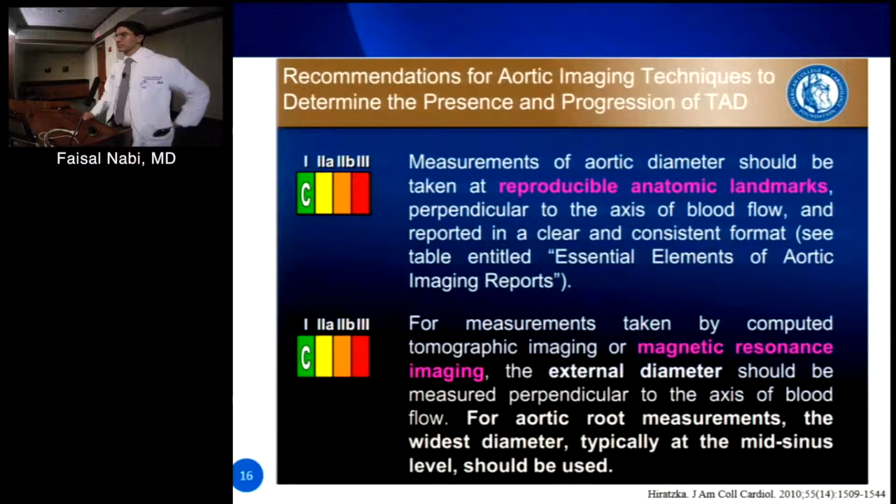You really are not. In the best situation, you will take away the thickness of the posterior wall or whatever that grade is. Yeah, that's in the best situation. So that would predict that echo is usually stick with the same modality.